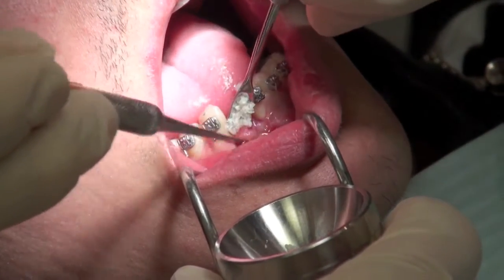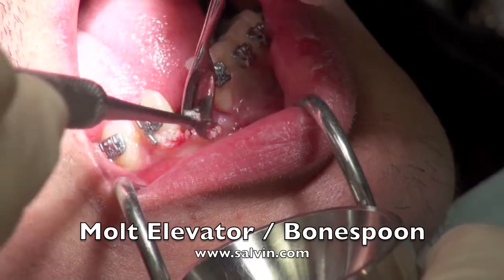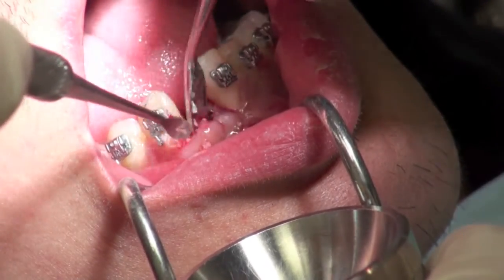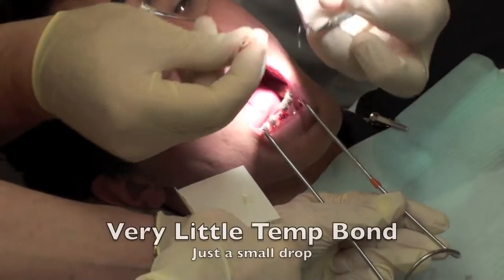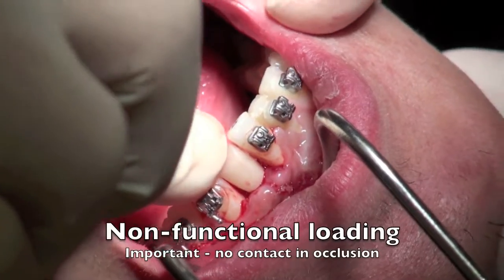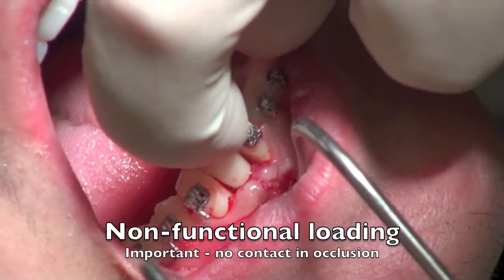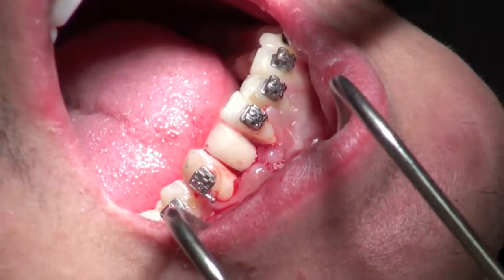In this particular case, we also added a little bit of allograft bone grafting material, carried to the mouth using a mold elevator and a bone spoon, just to bulk the tissue out a little bit. Once this is all in place, I'm going to take a very, very little bit of cement — this is a very important point. You don't want a generous amount of cement; you just want a very little amount to wet the walls of the immediate temporary abutment sleeve, because we don't want a lot of this cement expressing out into the sulcus. Just a little bit will hold this on tremendously and it will actually be quite hard to get off after three months of healing.